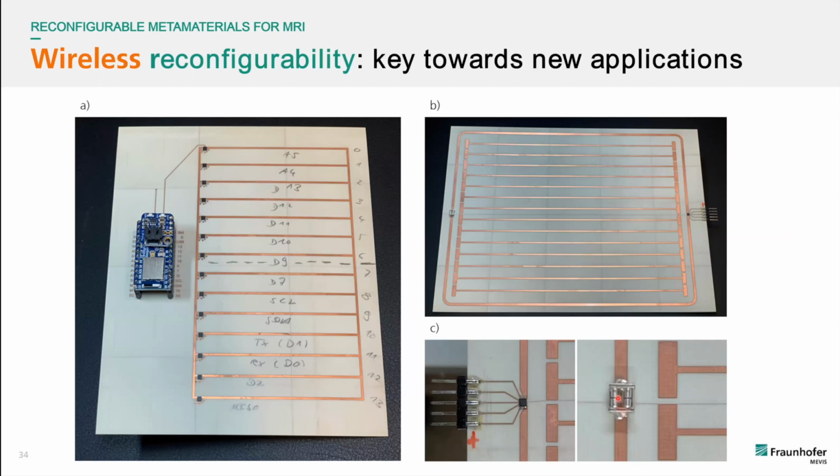Again, we have this varactor diode in there so that we are only running this in receive mode. But we can also make this switchable so that you can switch it on for the transmit part. But currently, we are only using it for safety reasons, only for the receive part.